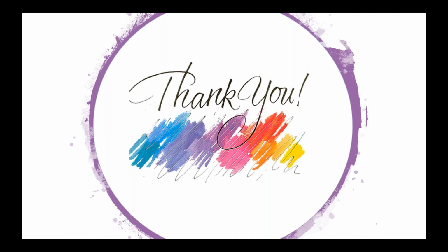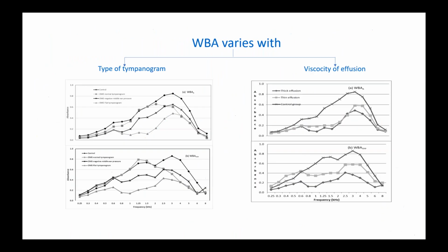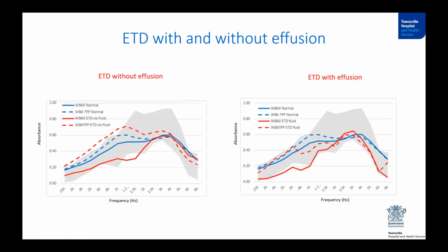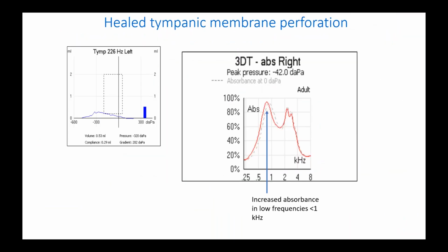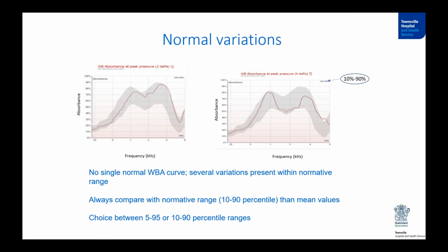What about the phase? You compensate with phase? When you give the reflectance, it's a measure. You can measure them separately. Like you can measure the phase separately, and there are two ways of giving the phase. If you take it as a phase angle, yes, you can present them as phase. But there's also another way of presenting these days, which is called group delay, which you state in terms of a time scale. So the similar phase information can also be given as a group delay. So the reflectance is a combination of admittance as well as the phase. It calculates the reflectance and the phase, and then calculates the admittance based upon that.